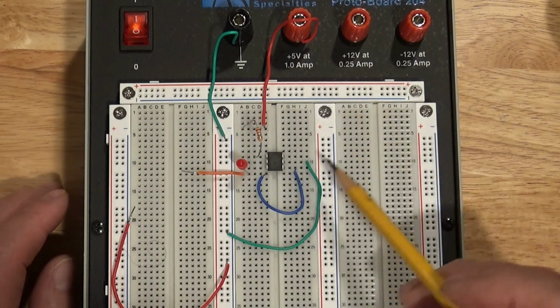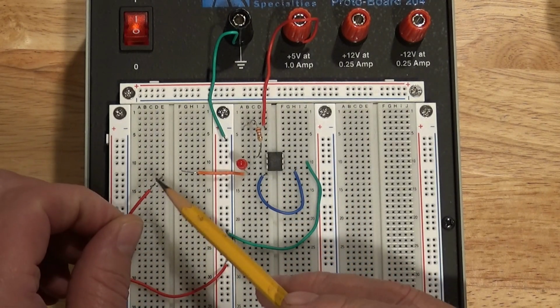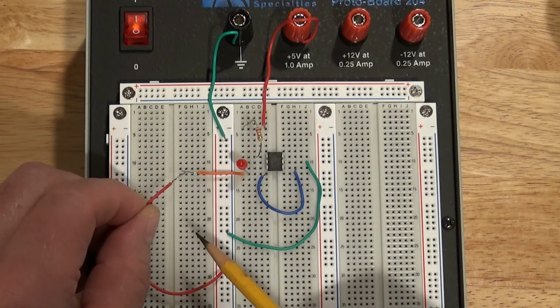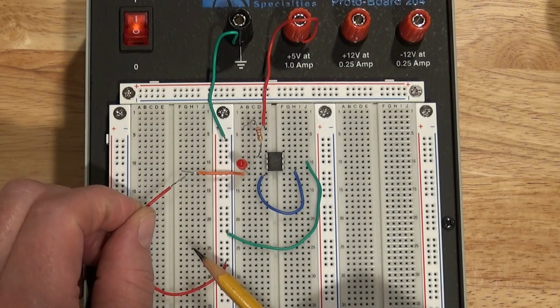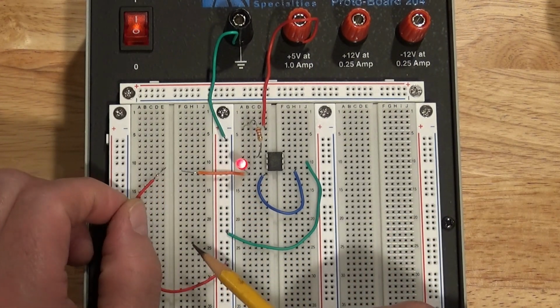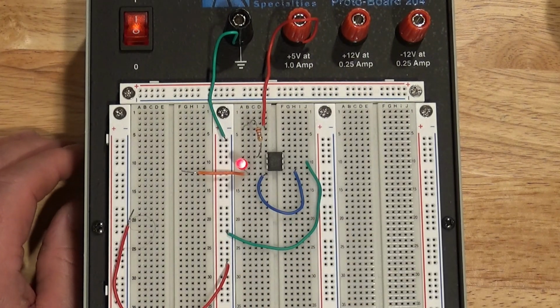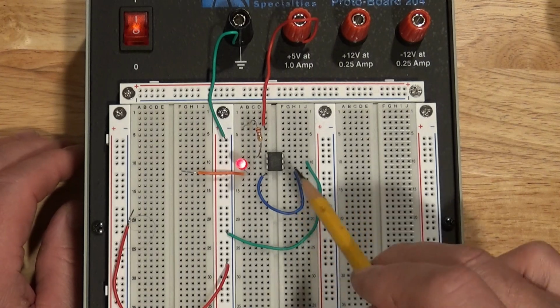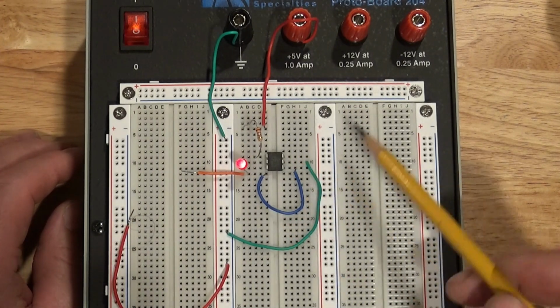And so you can see when this circuit becomes activated, this is the ground, which represents the ground probe. When you touch one of the tips of the microwire, you'd be doing this under the microscope, looking straight up at the tip of the array. You briefly touch it and you'd get a latched on LED. And you can see that out of the corner of your eye, and then you can look over while it's latched and record which channel it is and where it is in location to all the other electrodes in the array.